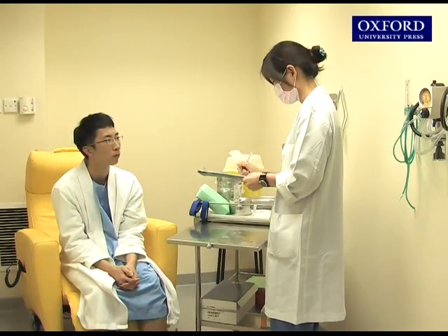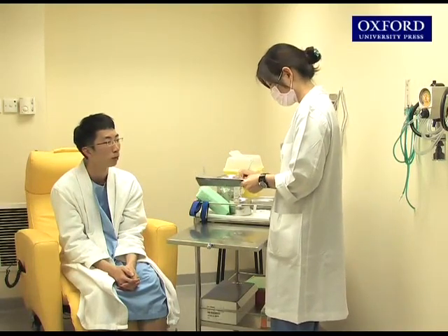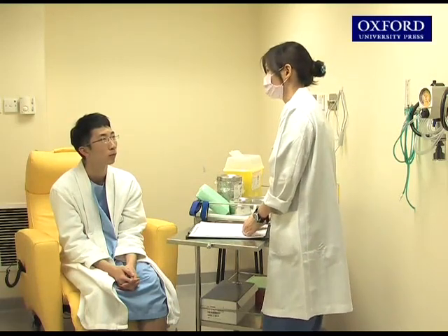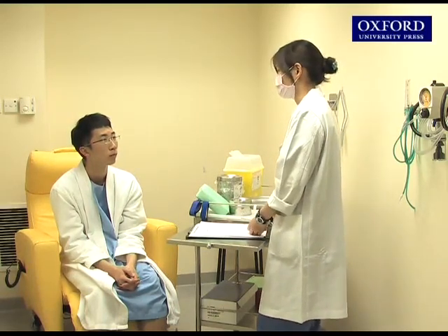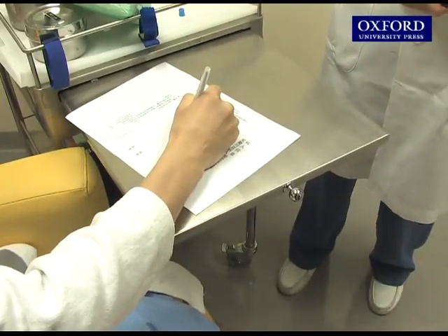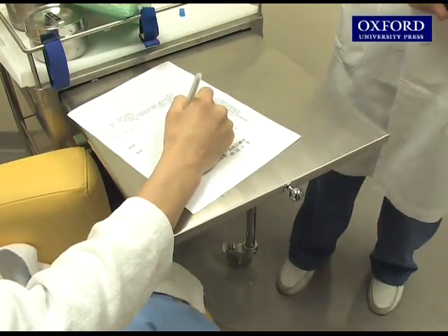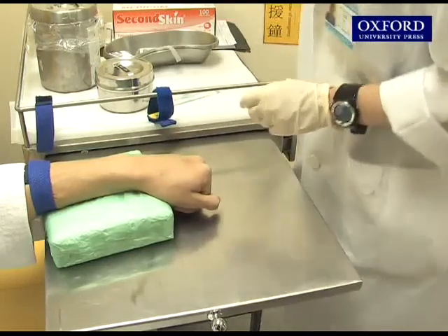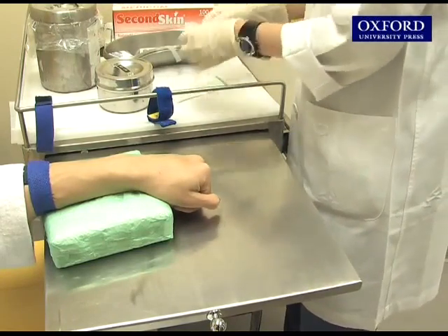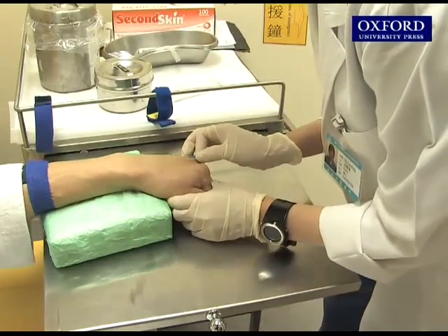Before the CT examination, the nurse will verify the patient's identity, confirm his or her health situation, explain the risks and the process of the examination. The patient must sign a letter of consent before taking the examination. For a contrast-enhanced CT examination, the nurse will insert a needle in a vein on the patient for later injection of contrast medium.